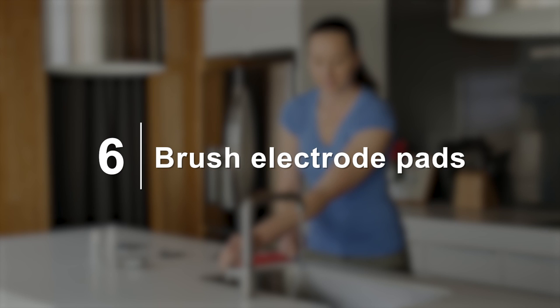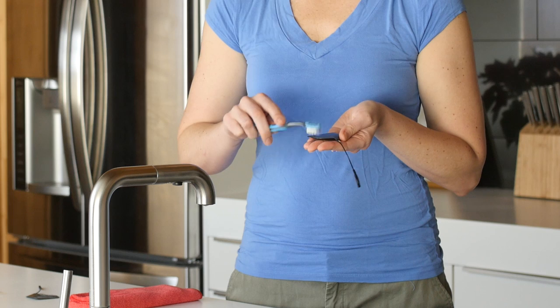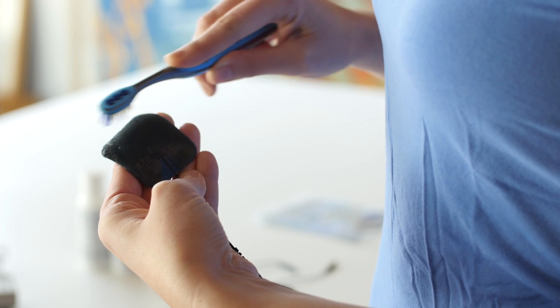Six: brush your electrode pads. Use a clean toothbrush and gently brush in one direction to expose the electrode stickiness, subtly exposing the underlying layer of the gel to get greater skin adhesion.